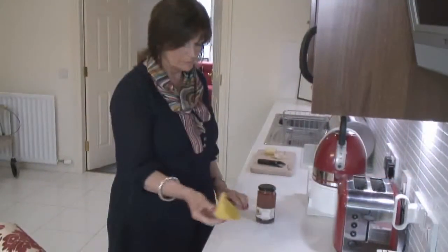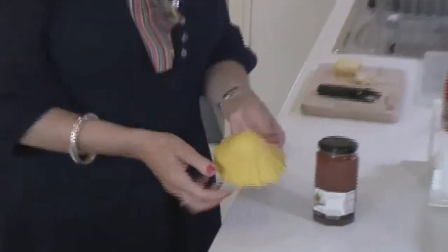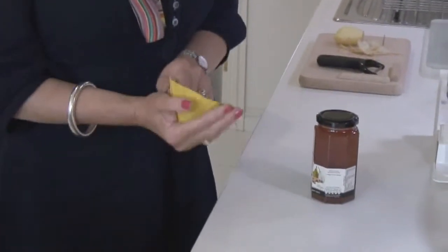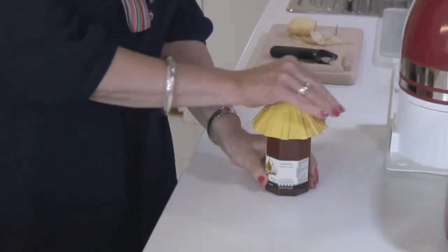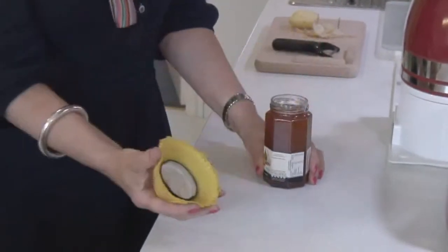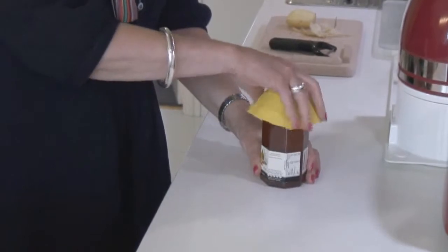The next item we have here is a jar opener. Now there are numerous types on the market. This is just a simple silicone moulded cone, and what you do with that is just place it on top of the jar, and what it will do is give you extra purchase, and it will also reduce the amount of strain that's going through the joints in your hand. So particularly useful if you have swollen, painful joints.